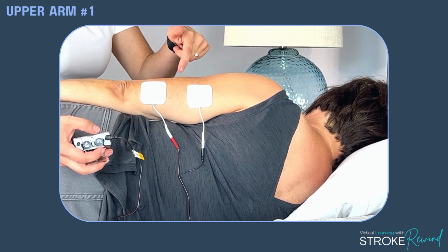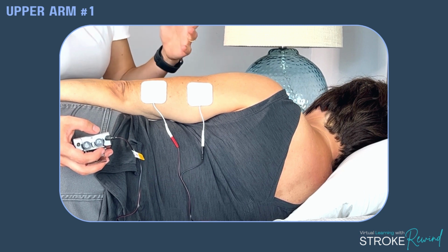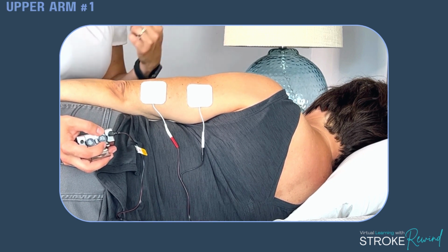And finally, think about it's moving, it's moving, it's moving. It's going to do that 1,000 times, or that would be really hard for me to do for her arm. So there's placement for the tricep. Let's move to the front of the arm or the bicep.